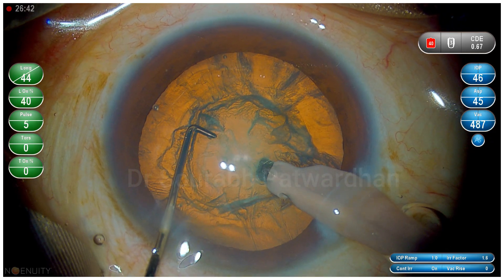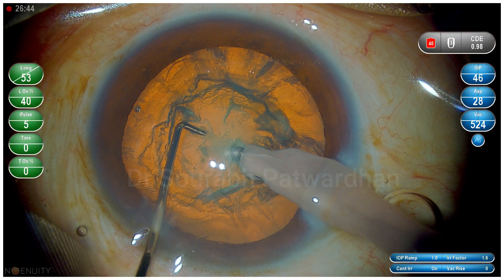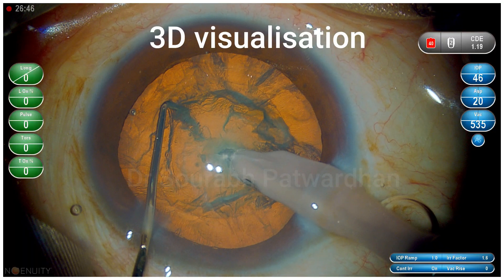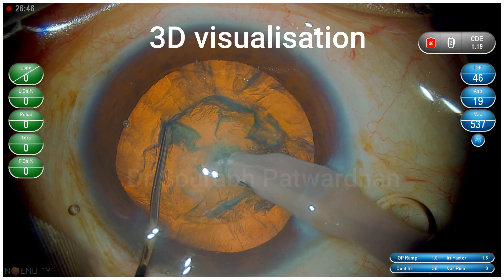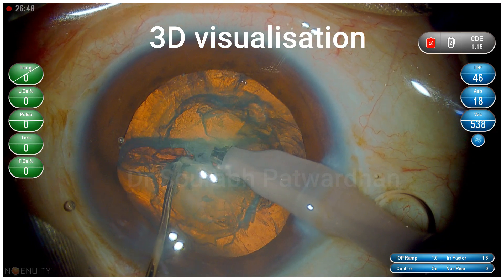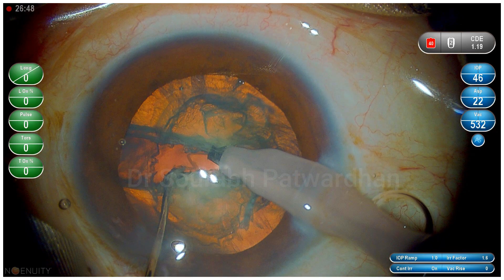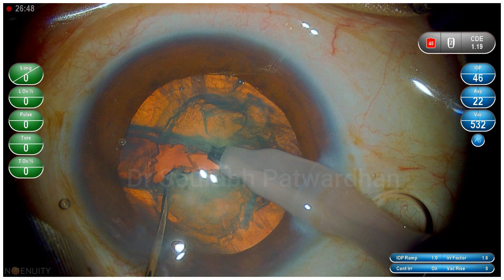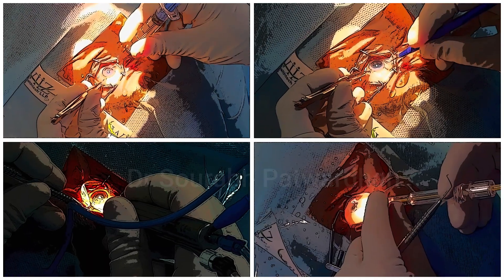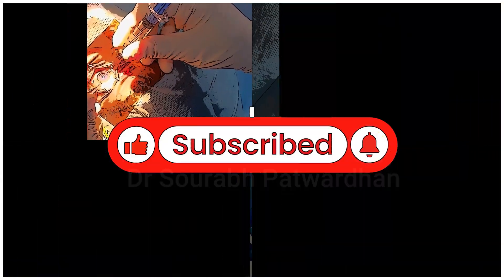Most important is to visualize from where you are going to start and what the angle of attack or angle of burying should be, so that it reaches the right depth, which is the center of the nucleus. For that, the 3D visualization is very important. Once you achieve that, you will get a perfect chop in each and every case.